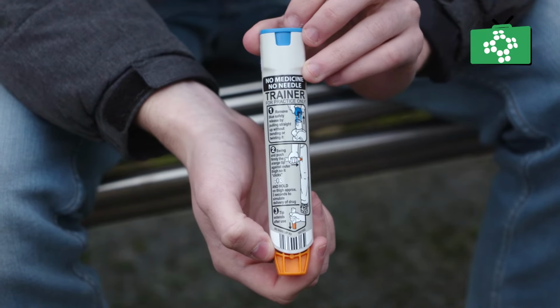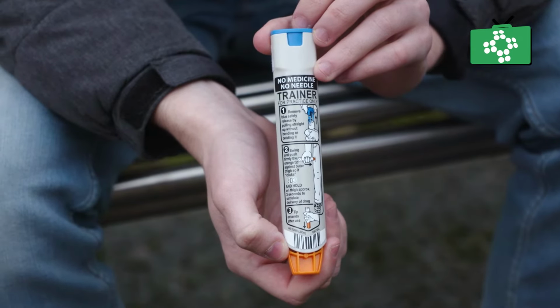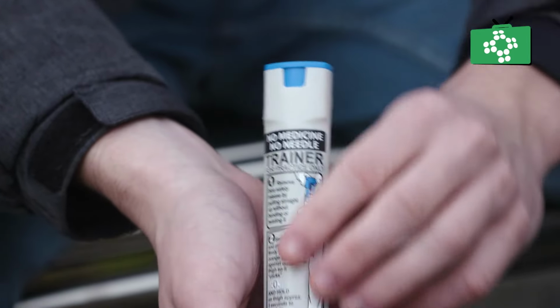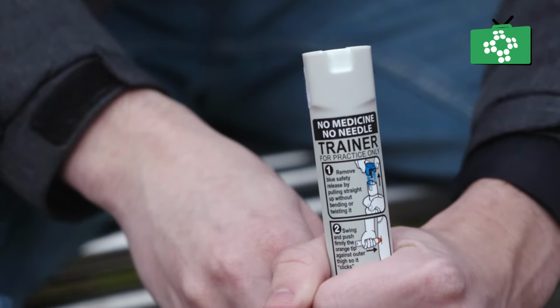There are easy to read instructions down the side of each pen, and these should be read to make sure you use it correctly. The blue cap shows you the top of the EpiPen, and this is the safety cap, which makes sure that the needle doesn't come out when not in use. Once removed, the unit is live. The cap can be replaced without the EpiPen being used. However, you must do so carefully, as you could accidentally inject yourself with adrenaline.